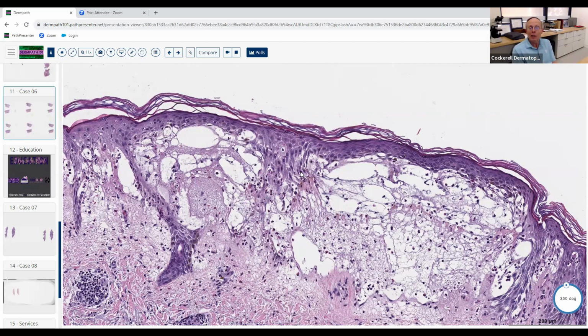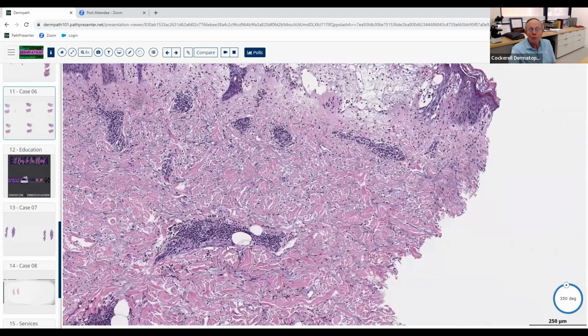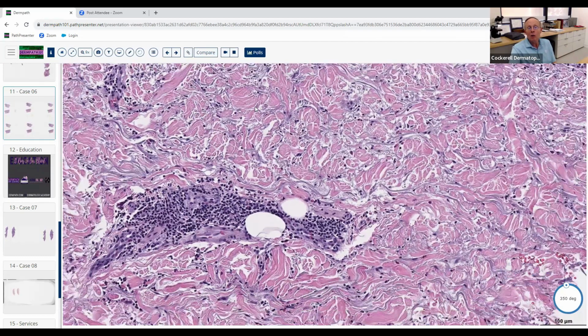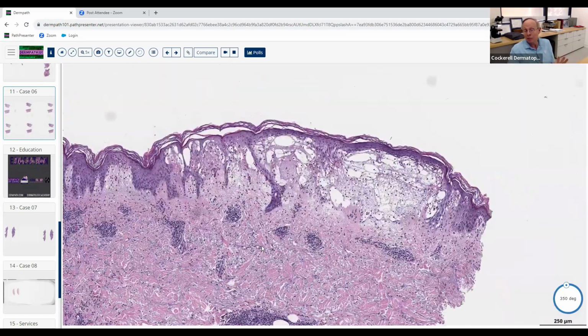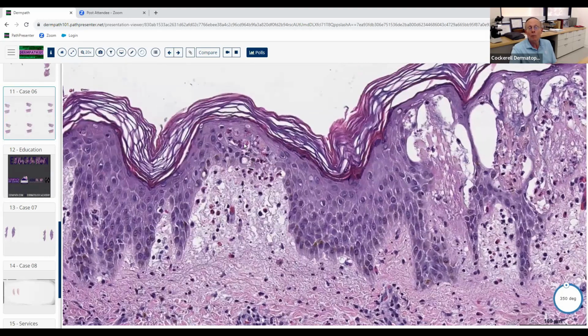And then you get a lot of inflammation, and then you start getting spongiosis, you get the blistering, you get eos, you get lymphocytes. You can even get some deeper dermal inflammation like down here. So this is sort of a later lesion of DH. So it's a little bit kind of confusing. But if you look at some of these other areas where you see the neutrophils at the tips of the dermal papillae coupled with some of these eosinophils, that's helpful.